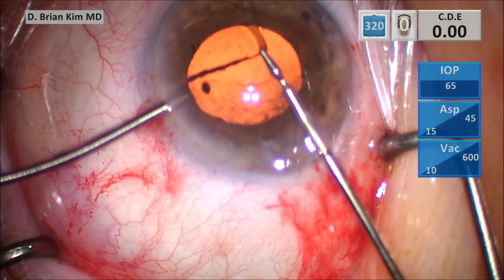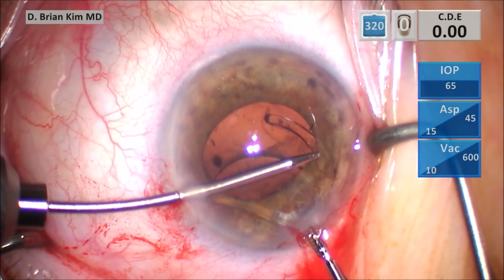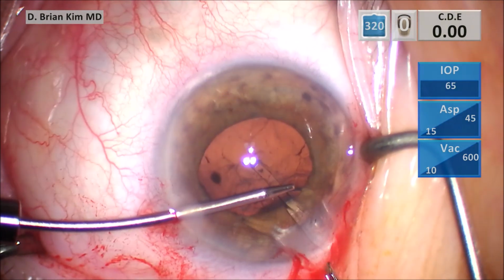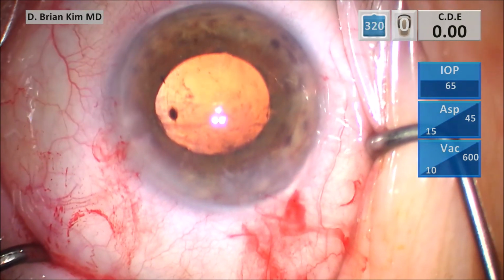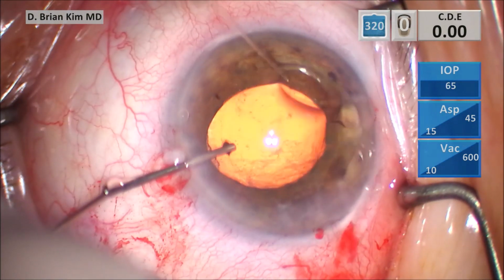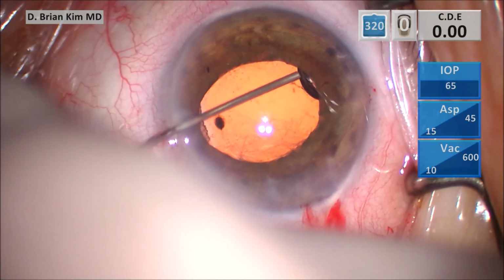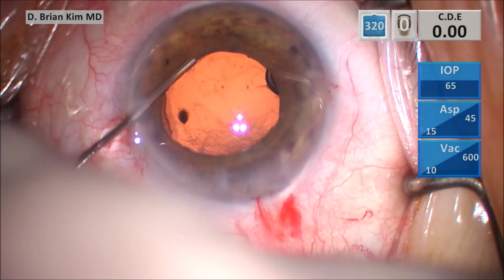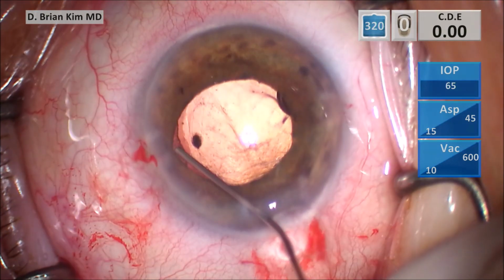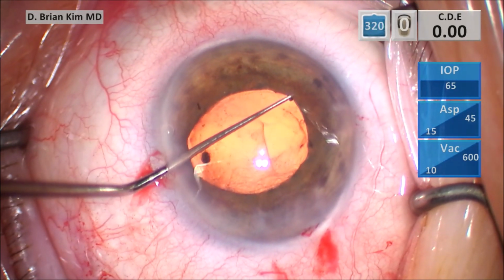And then I grab that other cut edge and I'm able to, again, do the same technique. As I pull the lens out, I make sure that the haptic doesn't roll up towards the corneal endothelium, shielding the corneal endothelium with the left side forceps. Push some more cohesive viscoelastic, and I'm just going to assess what's going on with the bag. So again, why was this single piece acrylic lens placed in the sulcus when the posterior capsule is intact? So again, so far the posterior capsule is intact. I'm retracting.